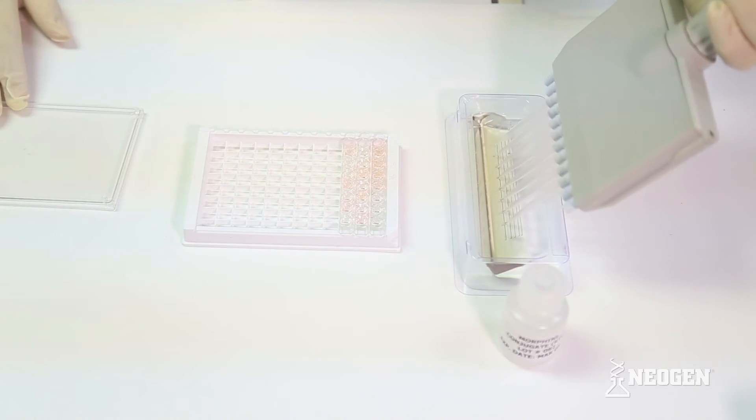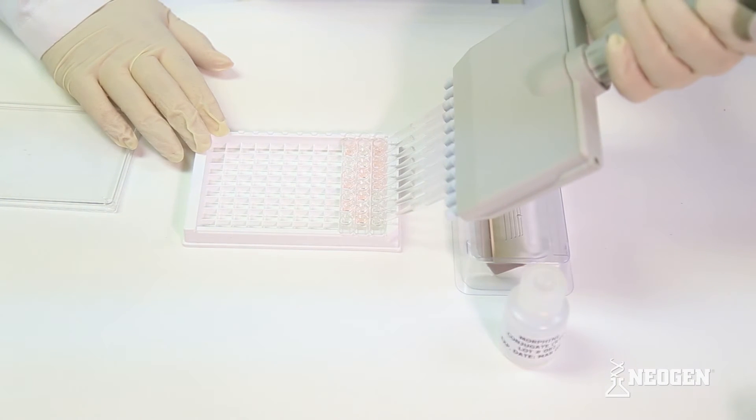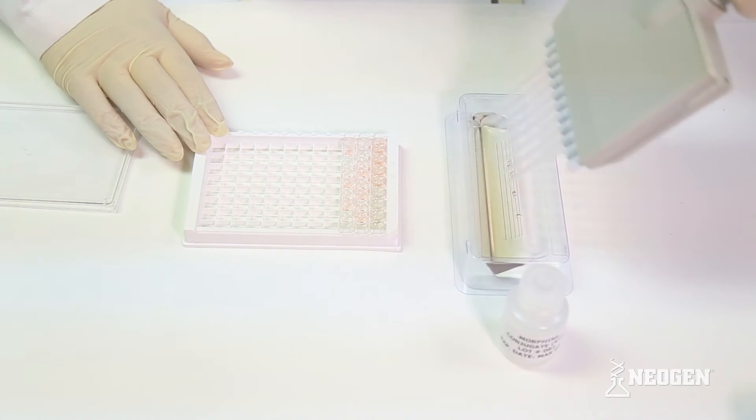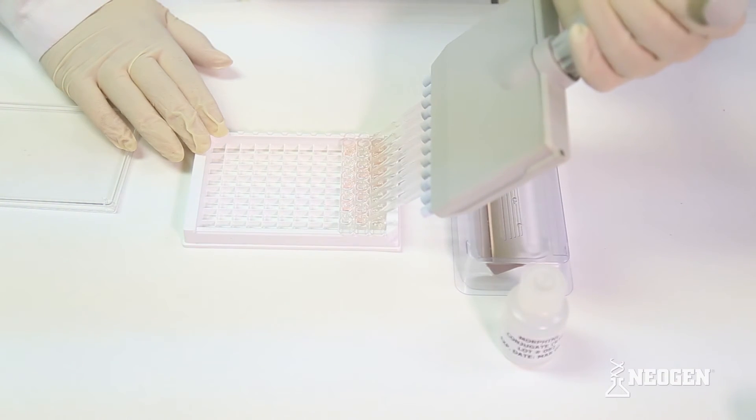Next, add the specified volume of the ready-to-use drug enzyme conjugate to each strip using an 8 or 12 multi-channel pipette for rapid addition. This step is time sensitive, so pipette as quickly and as accurately as possible. It is important to not allow the pipette tip to touch the inside of the well or any of the reagent already inside the well. Doing so may result in cross-contamination and inaccurate results.